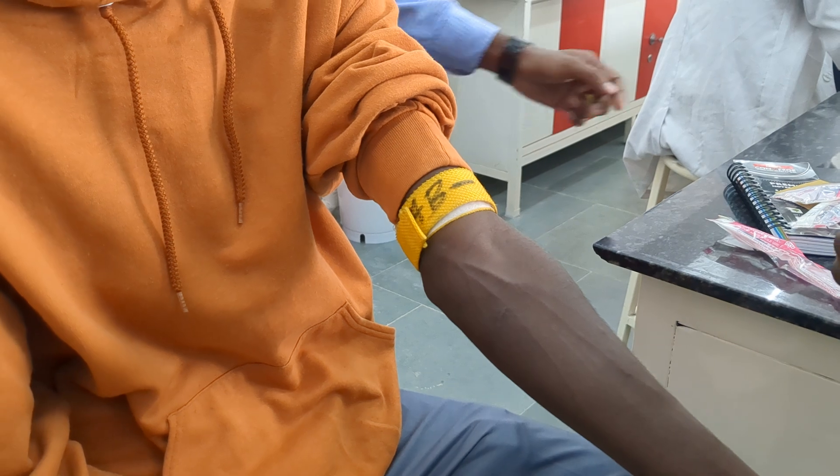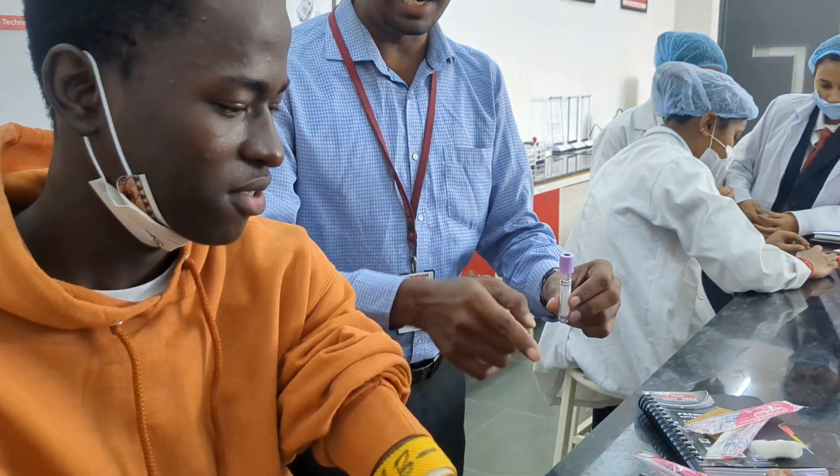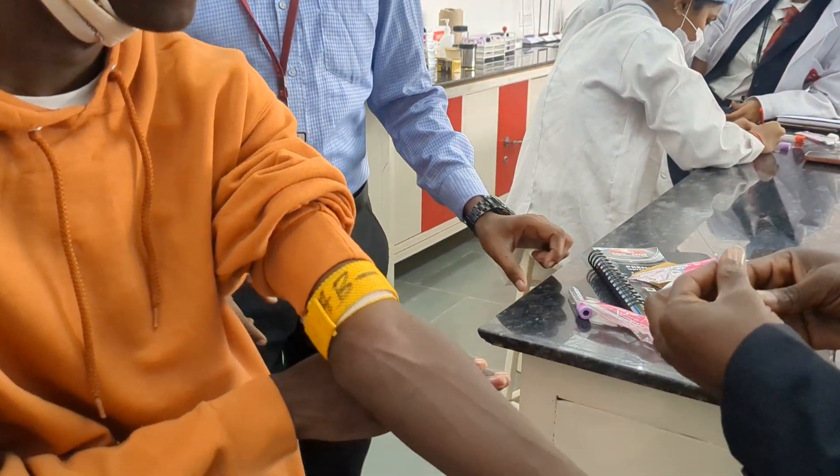Arrange your EDTA tube, label the EDTA tube, and start collecting the sample.